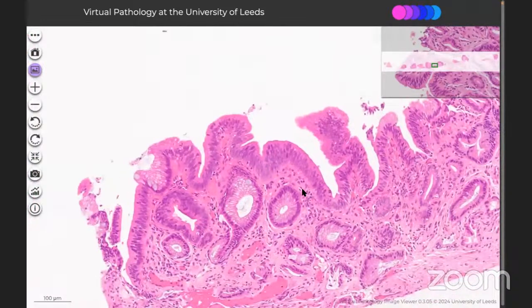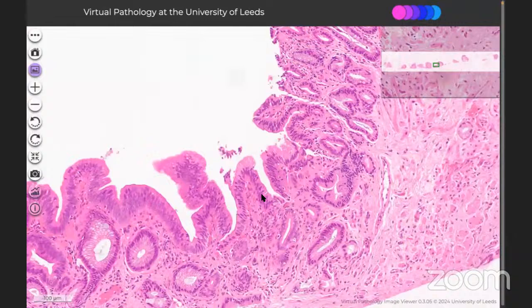So the first thing I will do, I will have a colleague opinion, number one. Then this is one kind of case where dysplasia needs to be confirmed with another pathologist, and Barrett is one of them. Please remember this, and they will test you whether you know this particularly. Okay, so you first confirm with another pathologist, a colleague pathologist in your department.